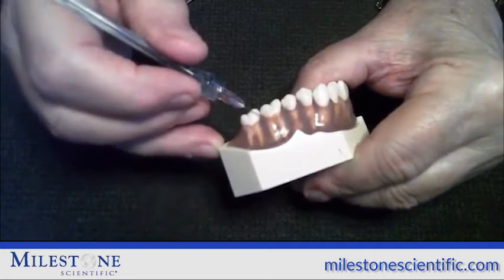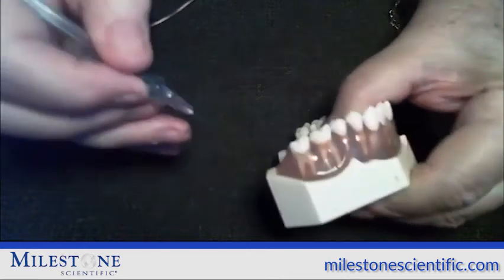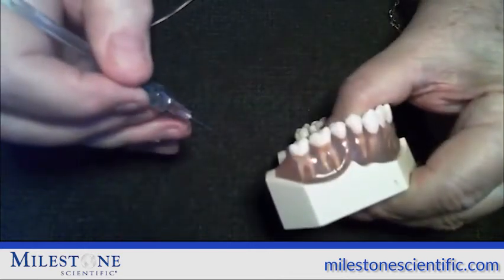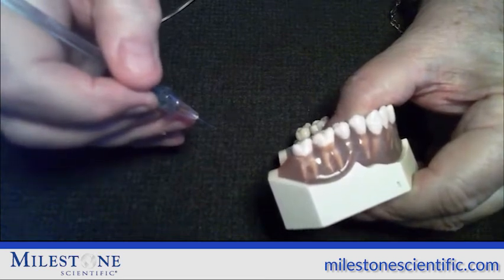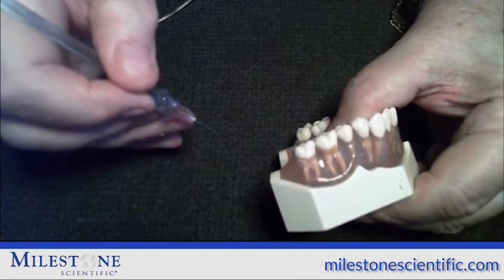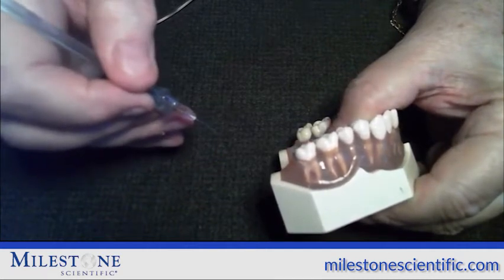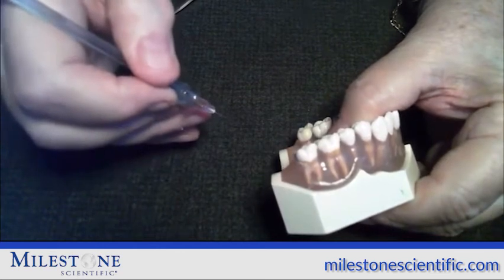So once again, if I delivered, let's say, a quarter cartridge of articaine or a half a cartridge of lidocaine, I then hit the foot pedal all the way to the floor, release it, aspiration starts. Beep, beep, beep. 1, 2, 3, take the needle directly out of the mouth. And then as the aspiration finishes, watch and see how much anesthetic comes out of that needle. It should be a drop or two. That's perfect. Where did that anesthetic go? It didn't come out. It went into the bone. You're going to have really good anesthesia.